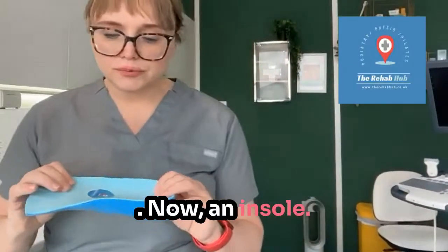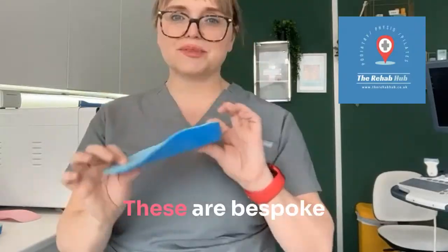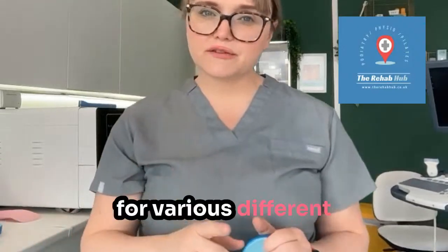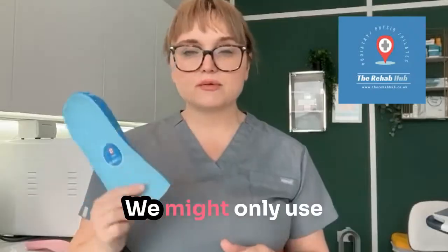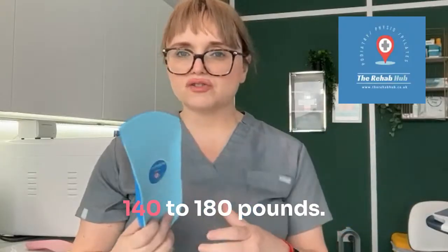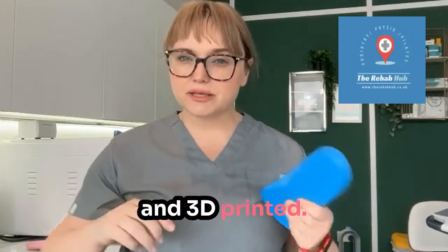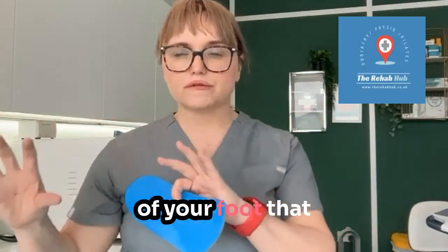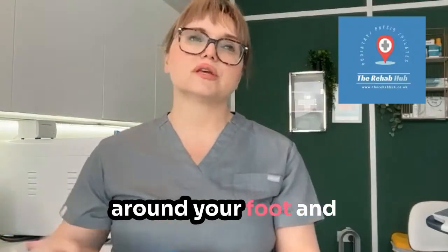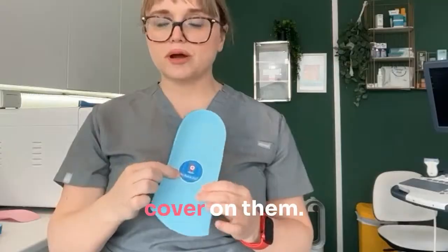Now, an insole. These are display models that Lulu actually made for us. These are bespoke made. In here, we use orthotic therapy for various different things, and we might only use these for about 12 weeks on a patient. These generally cost anywhere between £140 to £180. They're custom made and 3D printed. We take a 3D image of your foot. That goes to the software. We then build an orthotic around your foot and a prescription based on your pathology. This is then 3D printed and we put a top cover on them.